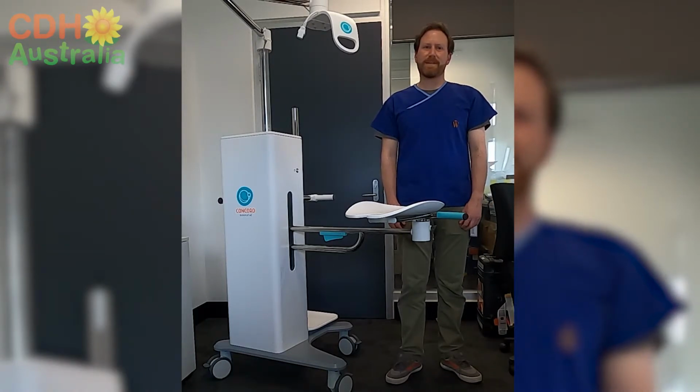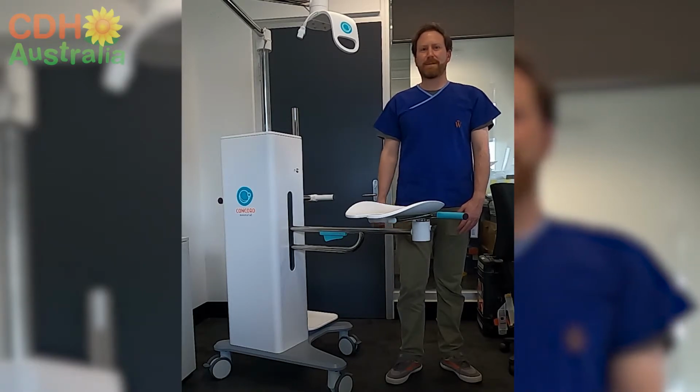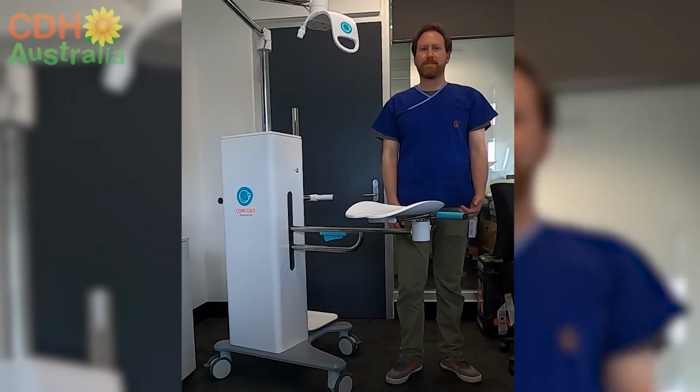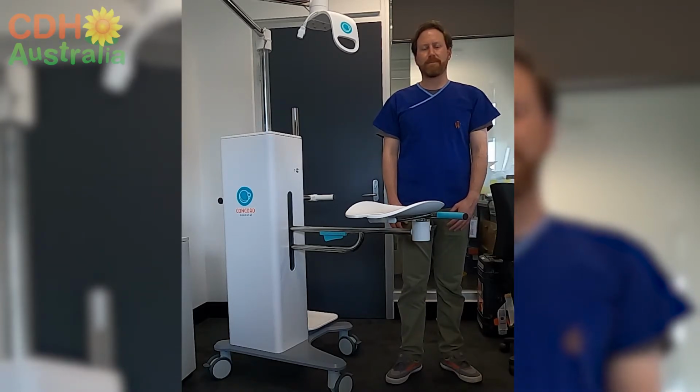Under traditional circumstances, what we would do when a baby with CDH is born is to immediately clamp the umbilical cord and provide breathing support at a specialized resuscitation platform over at the side of the room. Now, research done here at Monash and at the Ritchie Centre in the Hudson Institute of Medical Research has suggested that there may be a better way to provide help for these babies at birth. The way that we can do that is actually to provide the breathing support and get air into the lungs before we clamp the umbilical cord.